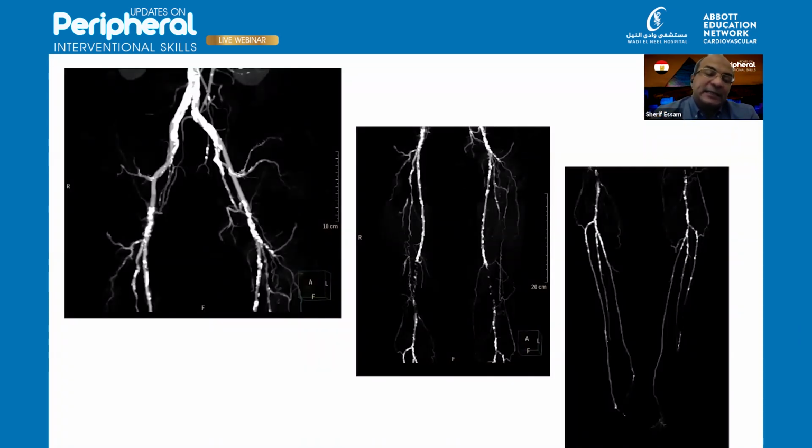That was his CT angiography, and as you can see, it shows quite a good amount of calcification at the aortoiliac and in both common femoral arteries, as well as in the media. He's complaining from the left leg, so I'll focus on the left arterial system now. As you can see, the common femoral artery is heavily calcified, here is calcification in the SFA, and then below the knee there is a nearly attenuated P2 segment and a heavily calcified P3 segment.